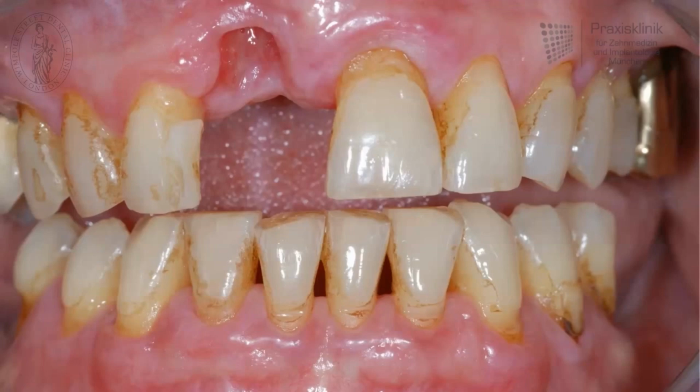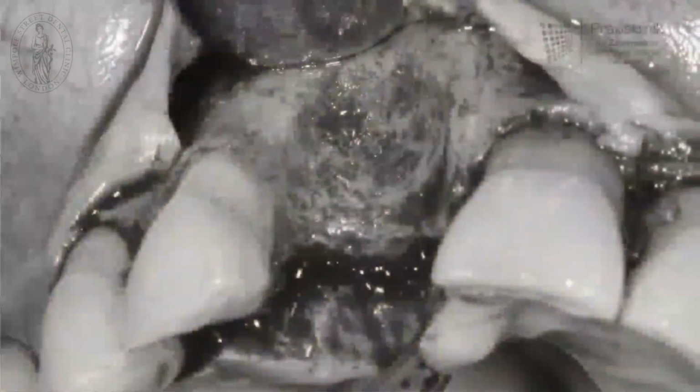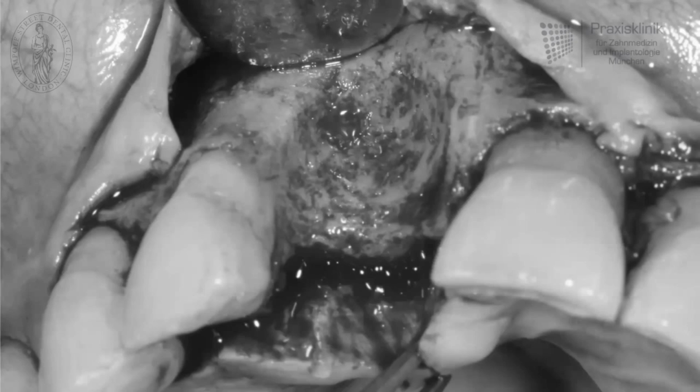With regard to an implant therapy, it is very important to first restore the bone of the jaw, and after that to have sufficient soft tissue around this bone to provide a natural and aesthetic result. In the top view we can see we have a three-dimensional defect with a massive loss of volume of hard and soft tissue. After elevating the flap, we can see the huge dimension of the defect in the bone, here marked in the red area.